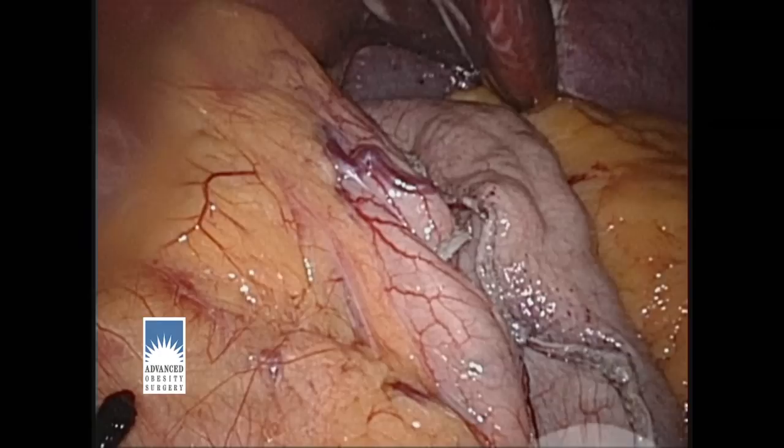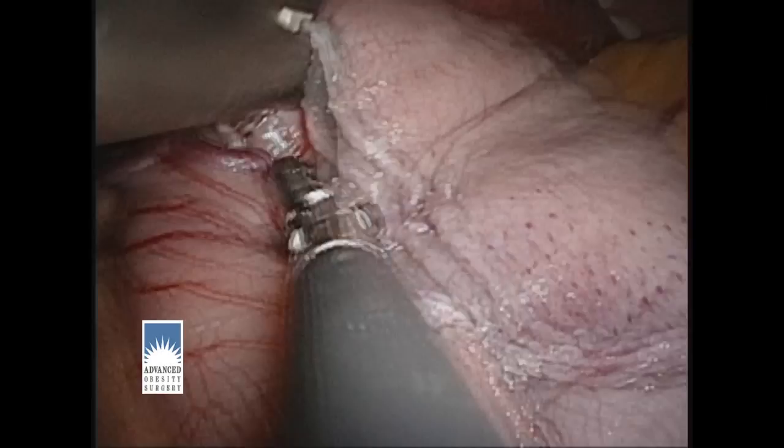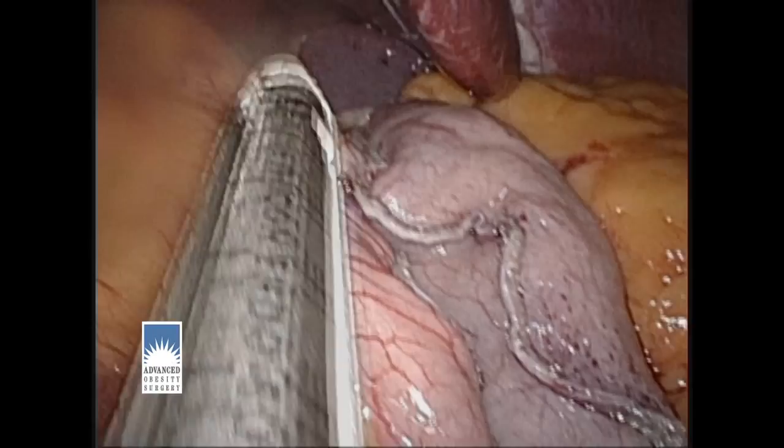We're nearly at the top of the stomach now and you can see the spleen dead ahead — that's the organ sitting up straight in the middle of the screen. We're positioning the final few firings of the stapler to complete the detachment of the stomach coming out to the right from the remainder of the stomach that will be left behind on the left. This will be the last firing of the stapler.